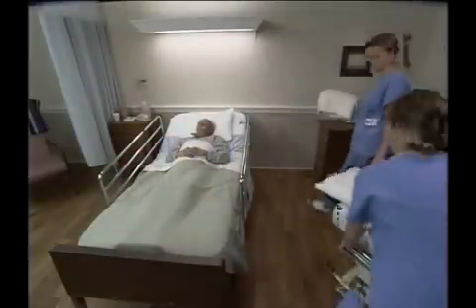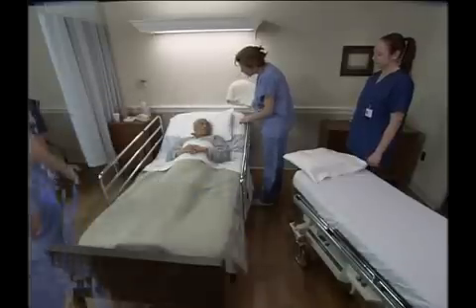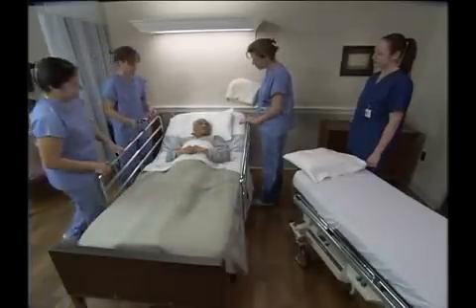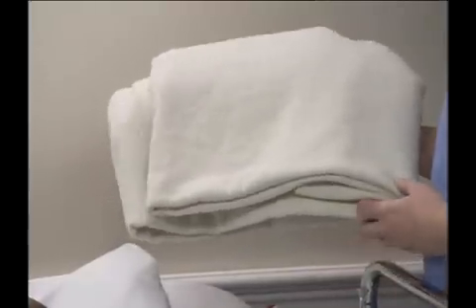Stretchers are used to transport people to other parts of a facility for surgery or diagnostic testing. Critically ill and comatose people are also transported on stretchers. To transfer a person from a bed to a stretcher, begin with your getting ready steps. You will need 3 co-workers to assist you, and you will need to bring a stretcher with a bottom sheet in place. You will also need a blanket with which to cover the person, and a lift sheet in position on the person's bed.